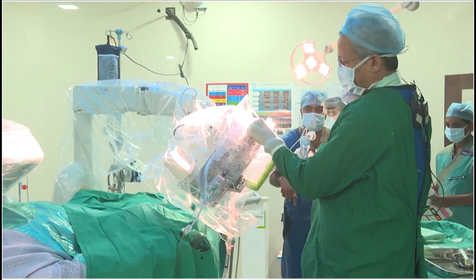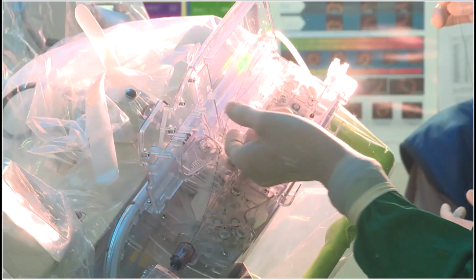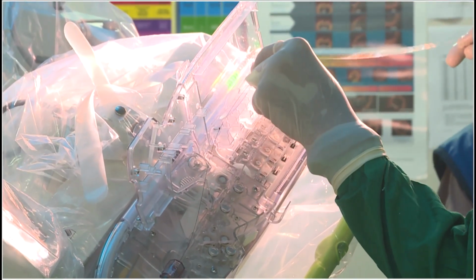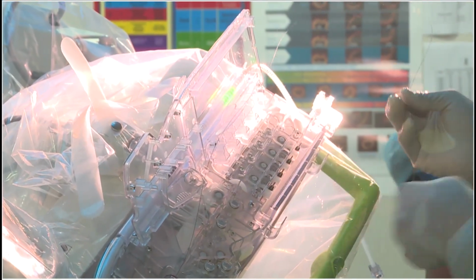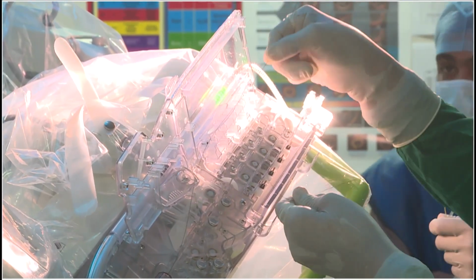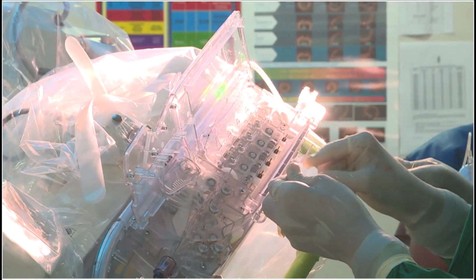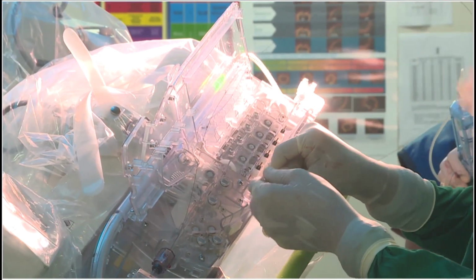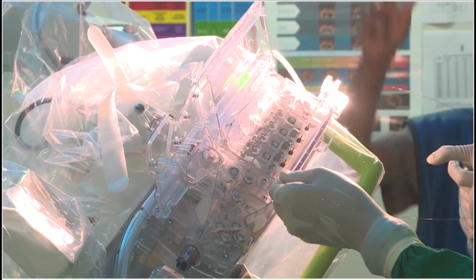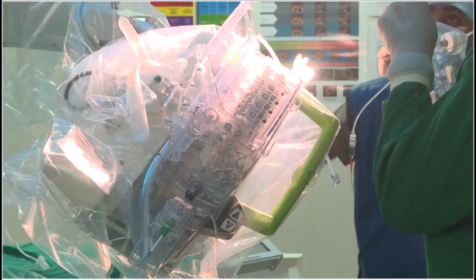So there are magnetic knobs attached on the cassette, which will control the movements of the guide wire. With these magnetic knobs we can have control, so the guide wire actually won't wobble around, right? There is a slot over here. We can use it to load the balloon over here, right? It allows very easy access to load the balloon over the wire.